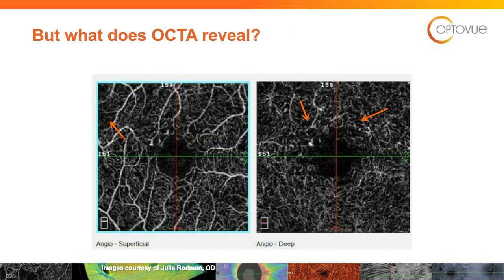Whereas this patient you may have followed in 6 to 12 months, maybe 12 months, now you're seeing changes where the FAZ looks enlarged. Capillary dropout. You're seeing the MAs here as well. This patient has some degree of ischemia going on, and this needs to be evaluated carefully, with education, and followed closely on both of those.